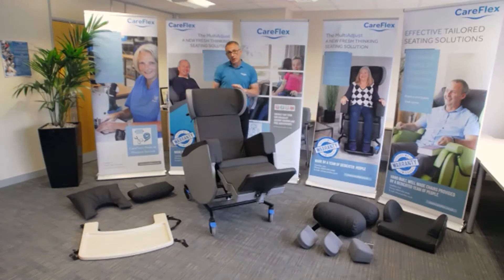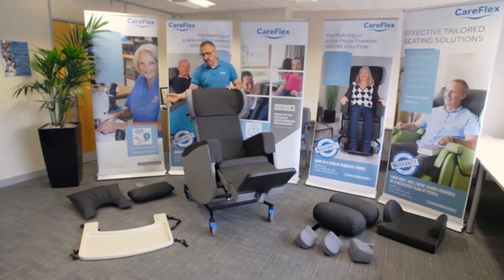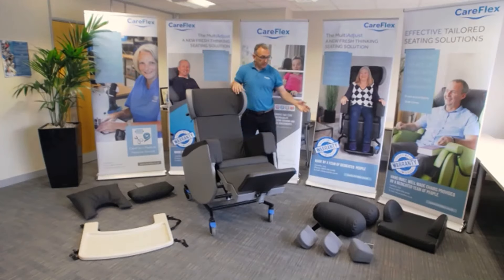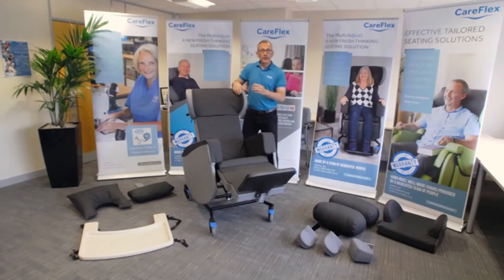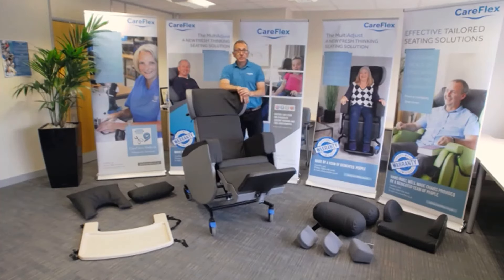There is a range of accessories available, including headrests, three different back styles, lateral supports, and a pommel. The chair is ideal for the multi-user environment, semi-ambulant users, and those with neurological conditions.